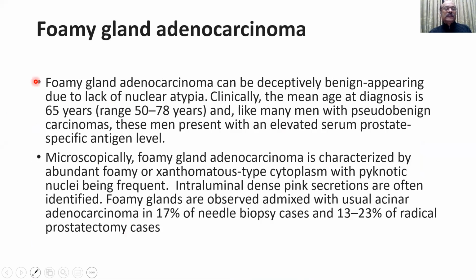The next variant is foamy gland adenocarcinoma. Foamy gland adenocarcinoma can be deceptively benign appearing due to lack of nuclear atypia. Clinically, the mean age at diagnosis is 65 years. And like many men with pseudo-benign carcinomas, these men present with an elevated serum prostate-specific antigen level.